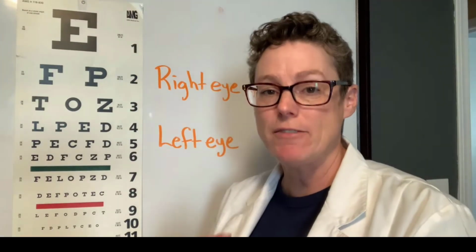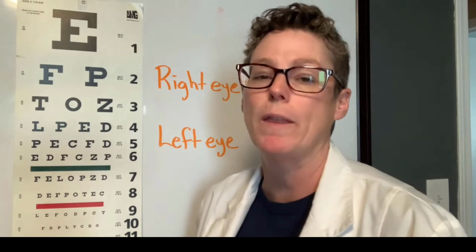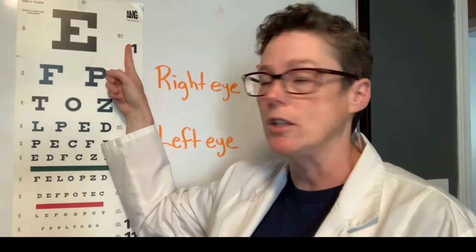Now when assessing the left eye, you want to employ a few different strategies to make sure they're just not repeating what they've just said to you. One of the strategies I will share is to start at a different line, so you don't have to start at number 1 like you did the first time.